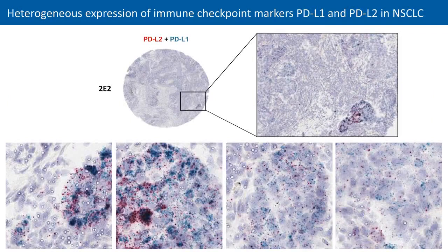A duplex assay for PD-L1 in green and PD-L2 in red for the highly inflamed core 2E2 also demonstrates heterogeneous expression throughout the selected area for both markers, as illustrated by the 4 higher magnification images on the bottom.